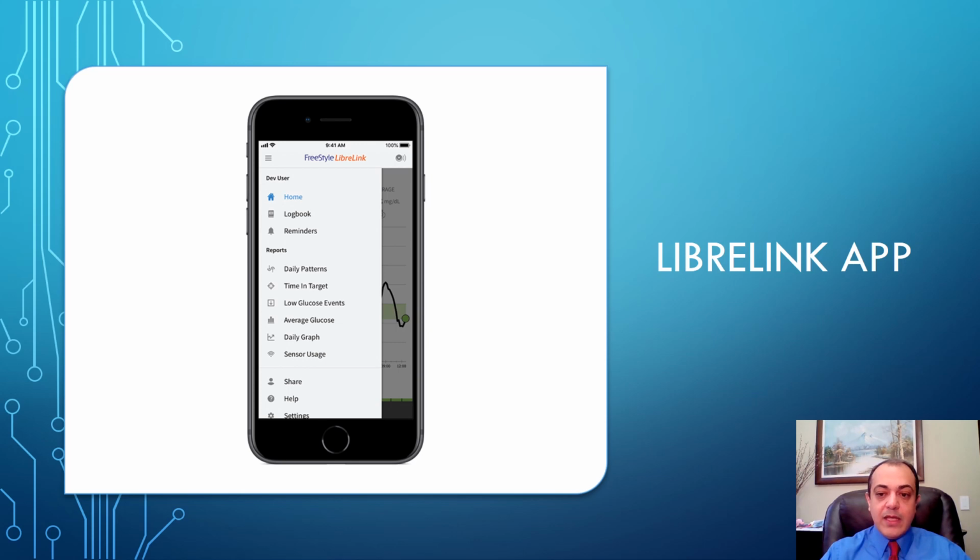Also, it can come in the form of an app. In this case, it's called the Libre Link app, which you have to download onto your smartphone and then use that to generate a report or to view your results.